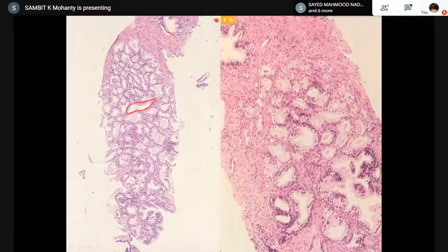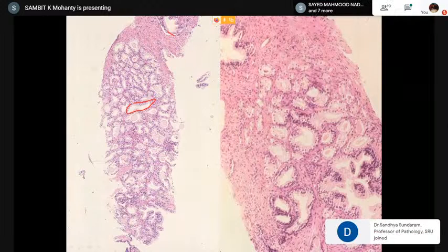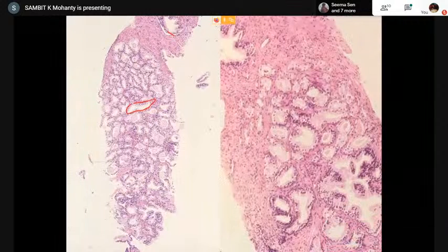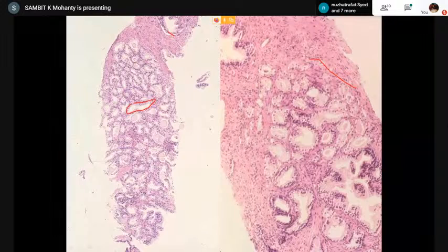But if you see here, there is some degree of infiltration. The small glands, the little twigs, they're kind of getting out. And here it appears to be a little circumscribed, but mostly it is getting out. It is not a very tightly packed structure like this one, compact and well circumscribed. It's kind of opening up, and the glands are in between.